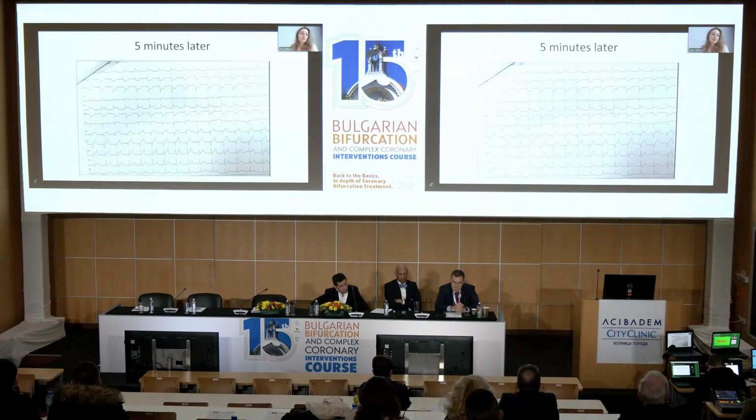And this was the ECG with ST elevations in anterior precordial leads. So after seeing this ECG and again the clinical presentation, I said, okay, there is definitely something in the left main of these abnormal coronary arteries. And the patient was urgently referred to the cath lab.